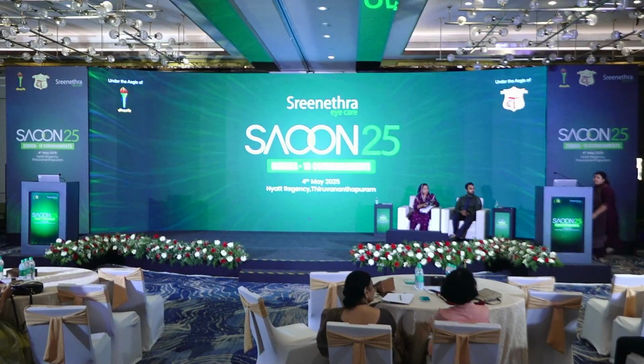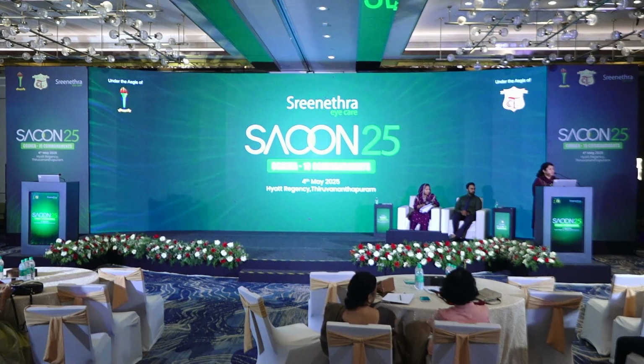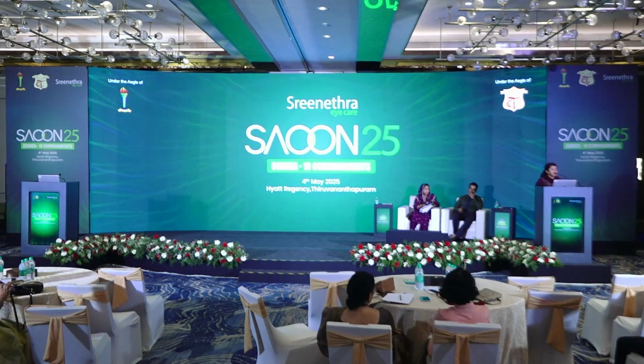Thank you. So, Dr. Niranjana, if I may ask you, for the benefit of our postgraduates and early practitioners, what are the kind of topography that you would absolutely not touch? What kind of cornea will you absolutely not go for laser vision correction?